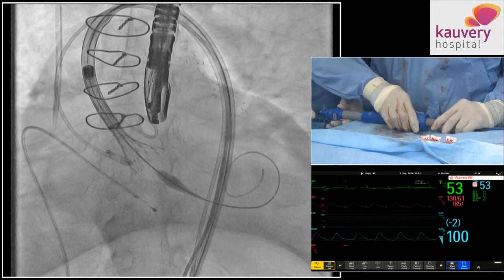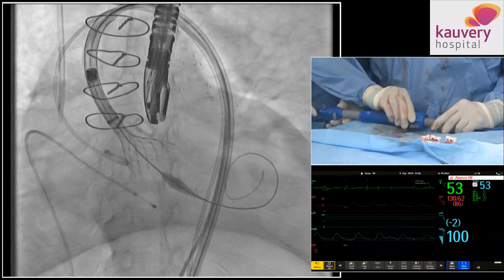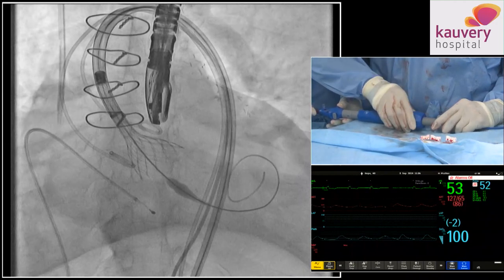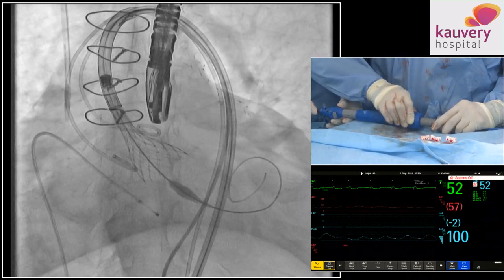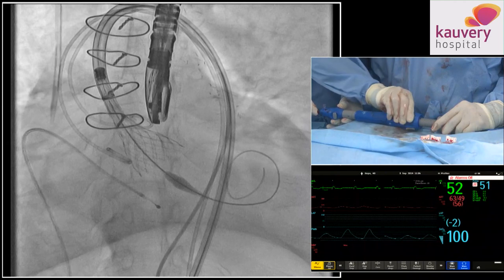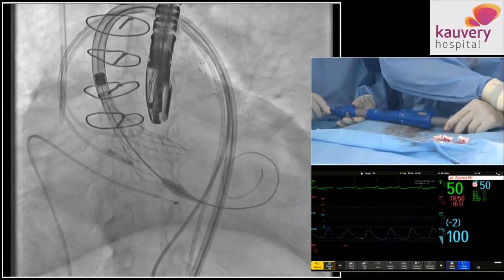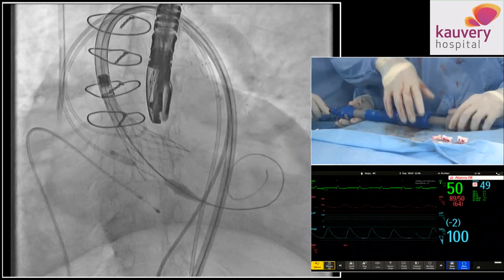We're making contact. Just stay there. No more wire manipulation, just leave it. Push forward? No, I'm fine, don't worry. Push, please. It's quite deep on one side. Push. You need to push forward. Okay, it's going deeper actually. Yeah, sliding down.